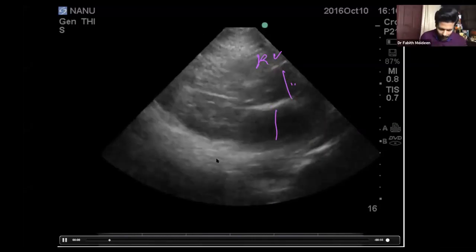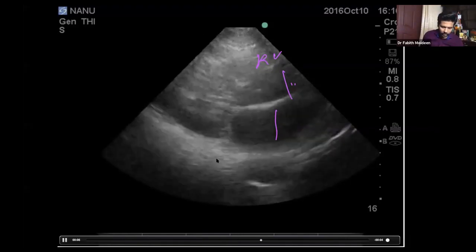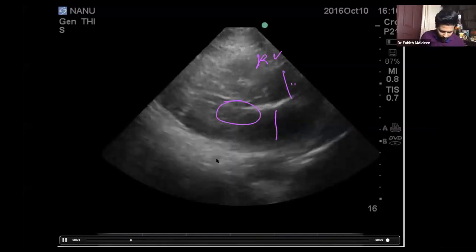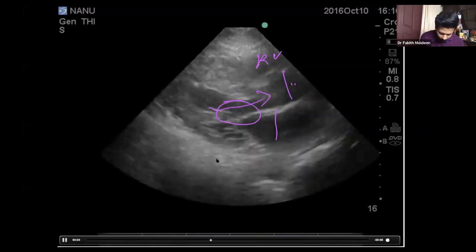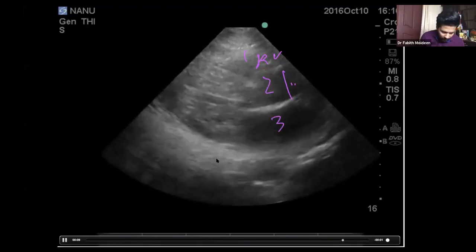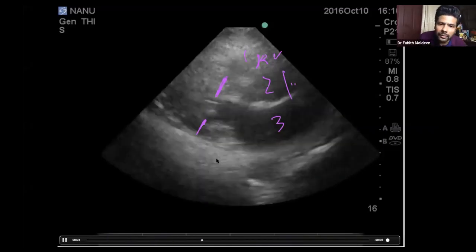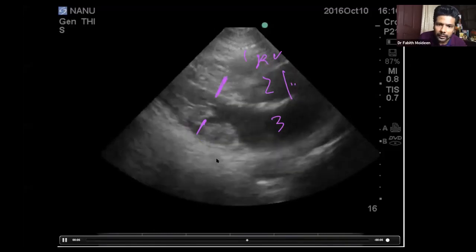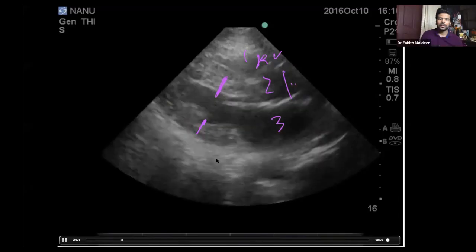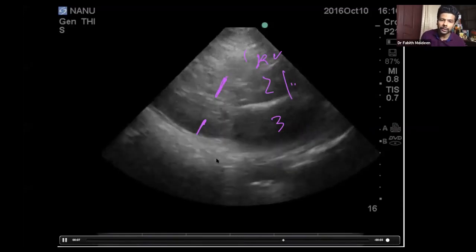So you can see why there is a kissing LV. If you really look at that mitral valve, it's completely obstructing the blood going into the aorta. I told you after rule of three, 1, 2, 3, the other thing you want to see is the wall thickness. Can you see that the septum is more thickened than the posterior wall? It's very thickened. And this patient had a syncope during exercise, so that is a very important history.